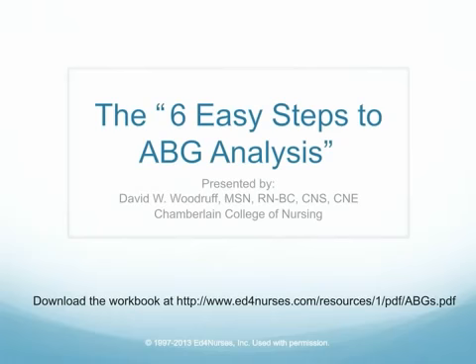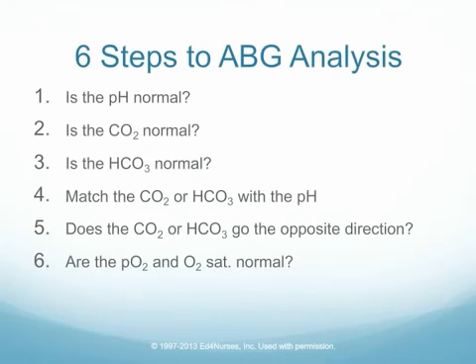Hello and welcome to the 6 Easy Steps to ABG Analysis. In this program, we are going to go through the normal values for blood gases, abnormal values, and interpret some blood gases to give you some practice with the major components of an arterial blood gas. So let's go ahead and get started.